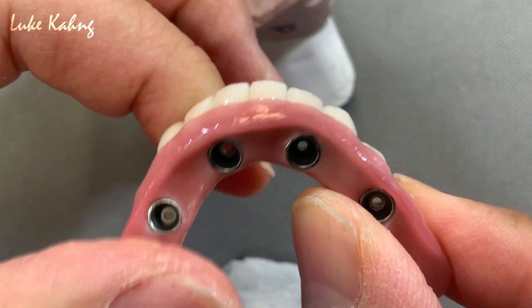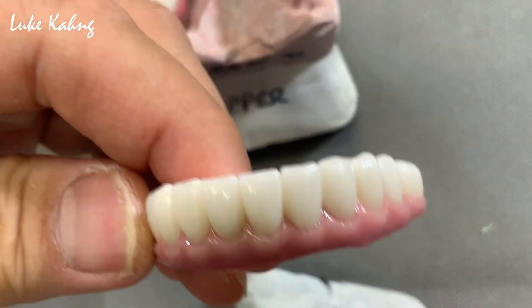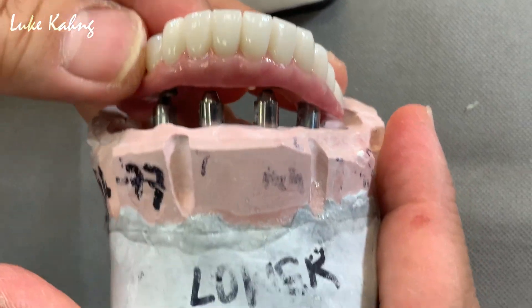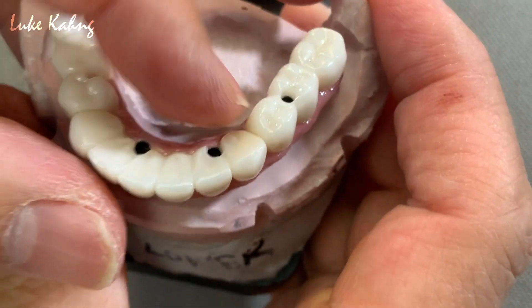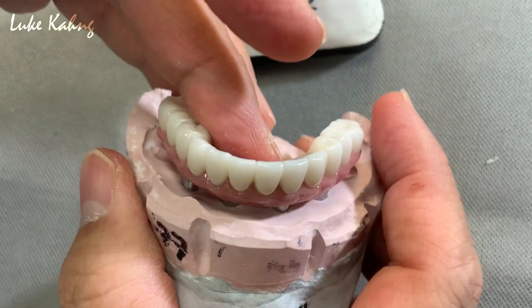All right, so this one — we cemented it together and then we can screw it down. It's because these are screw-retained cases.